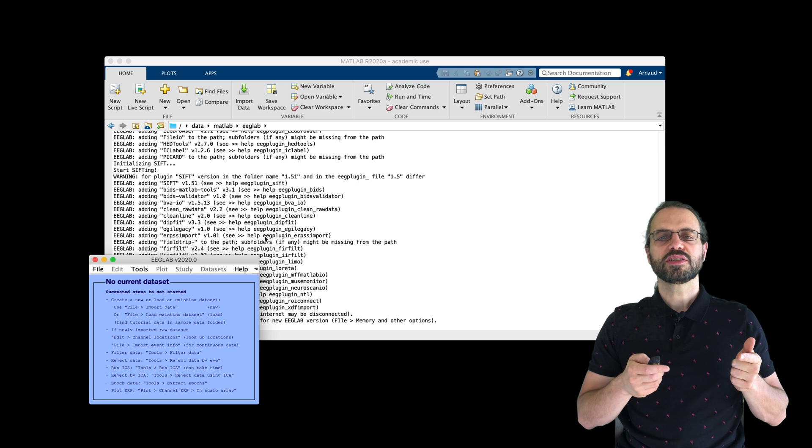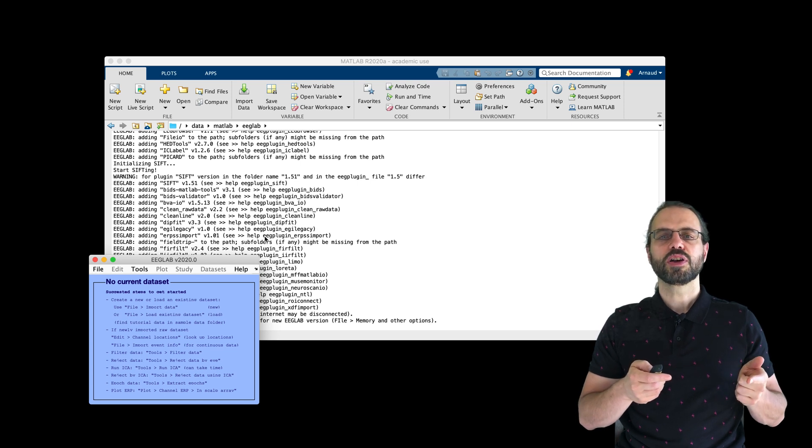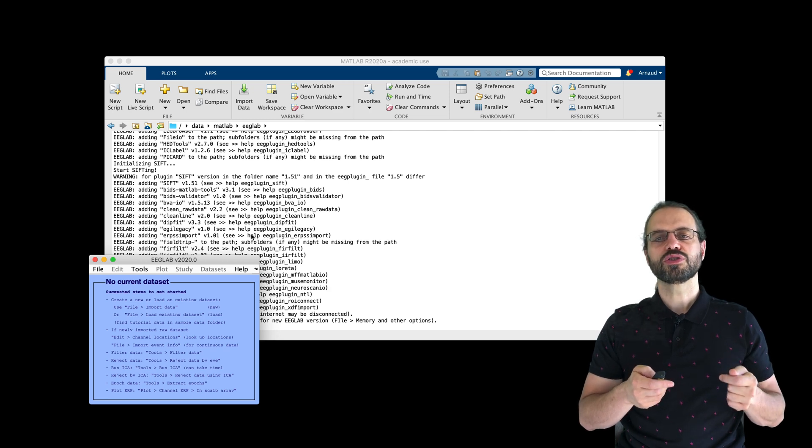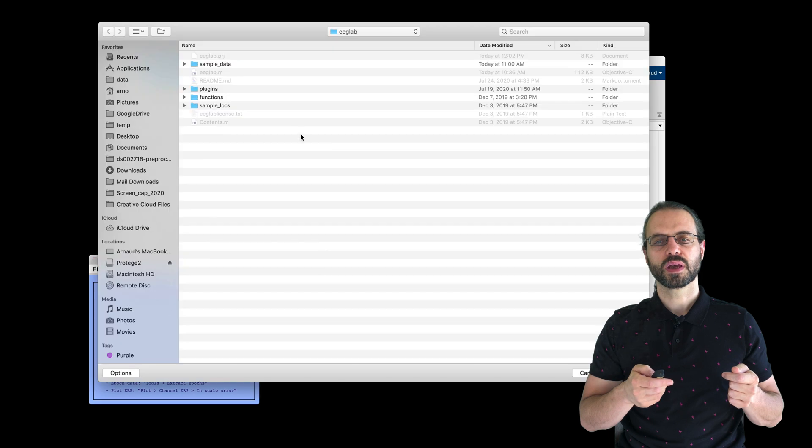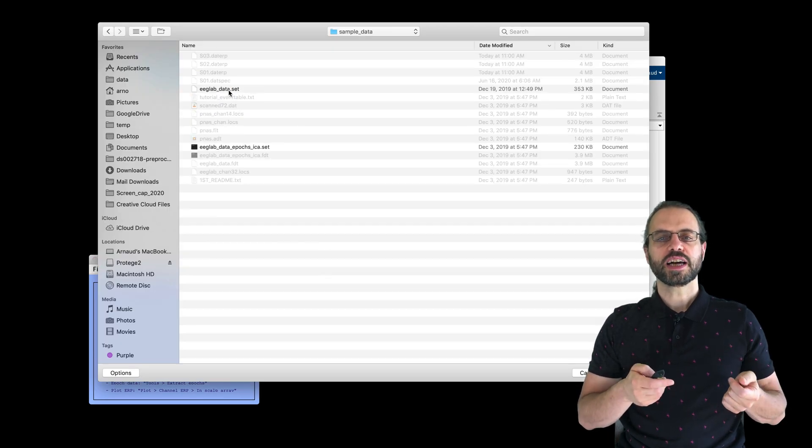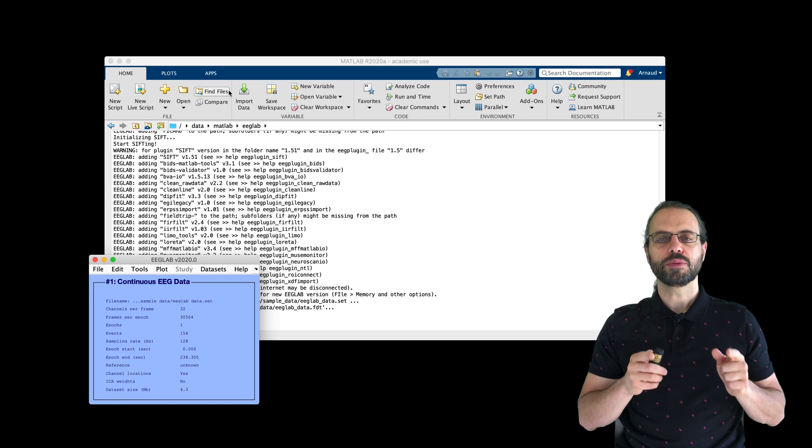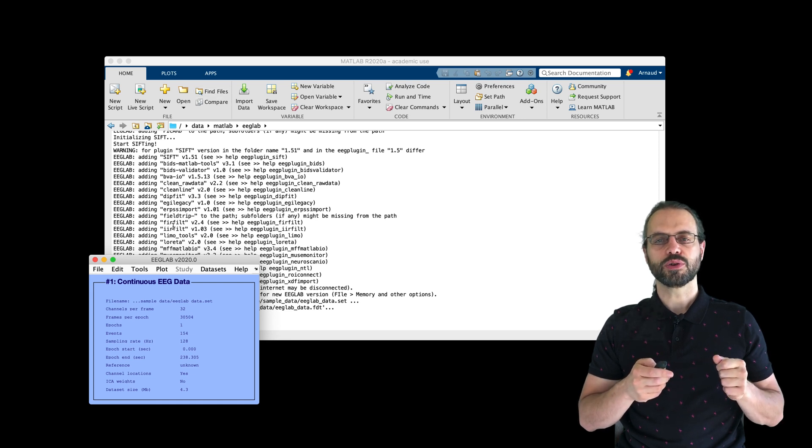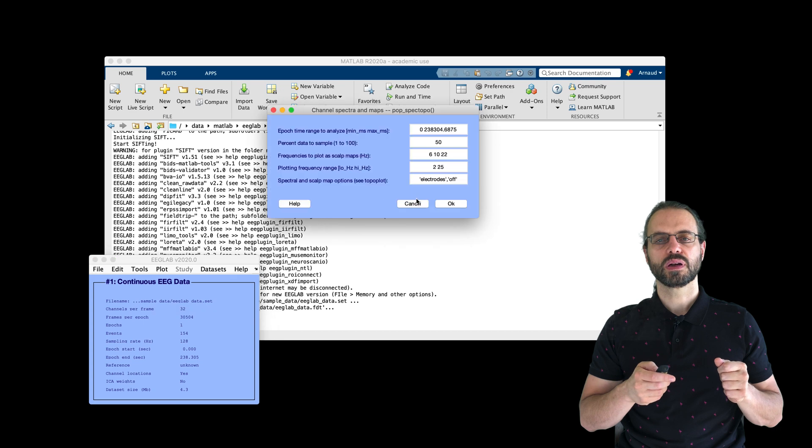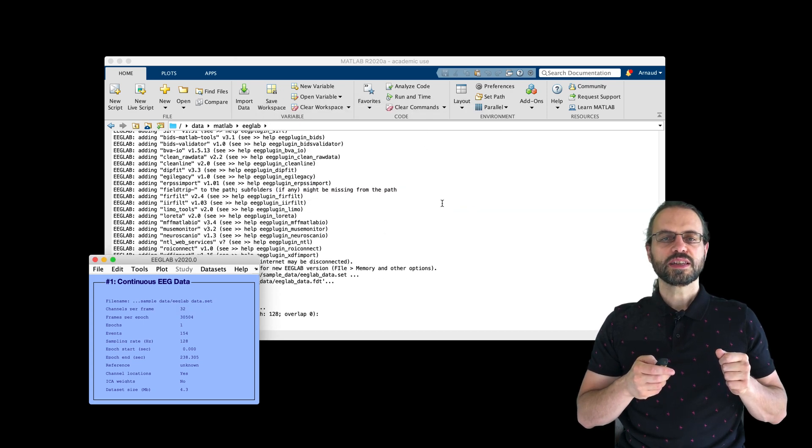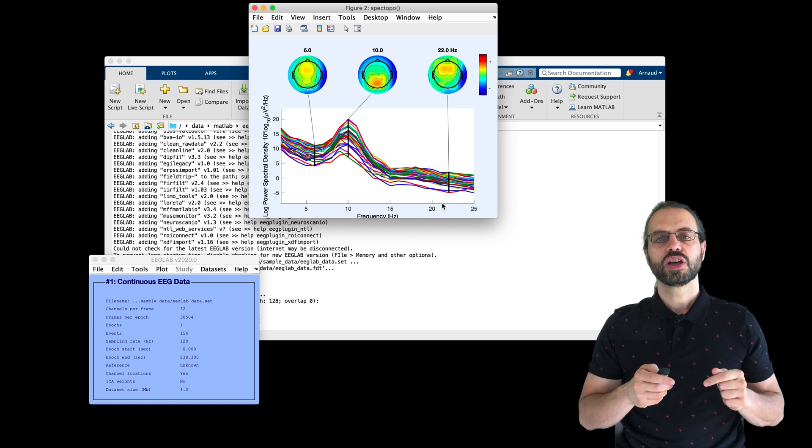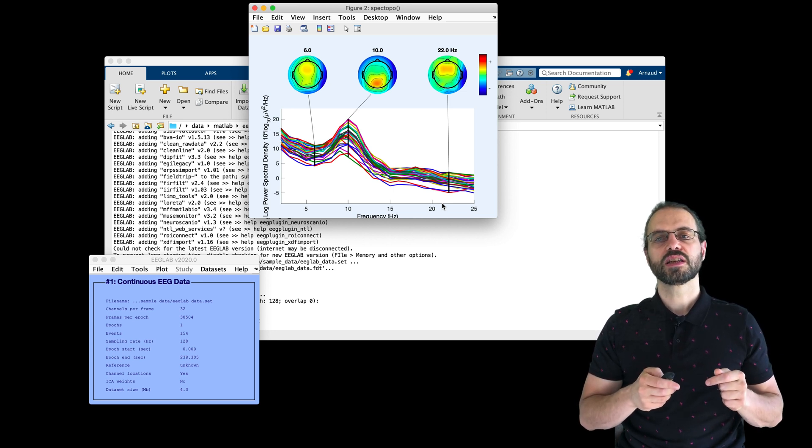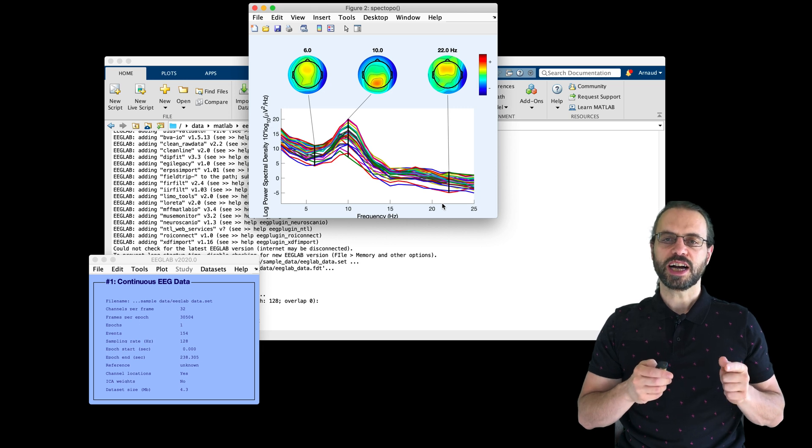So now let's run a simple example in EEGLAB with some of the included example datasets. For the spectrum, I'm going to use a continuous dataset. After loading it, I go to Channel, Spectra and Maps and simply press OK. We can see a nice peak in the alpha frequency range at 10 Hz, which is present in most subjects, even when they have their eyes open.